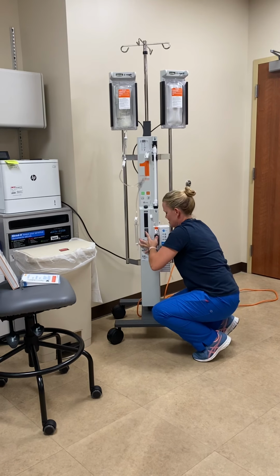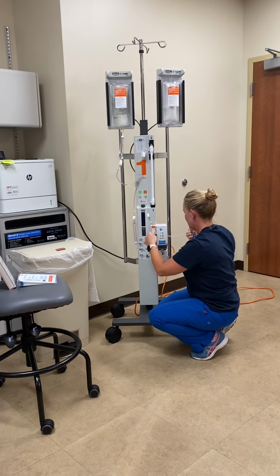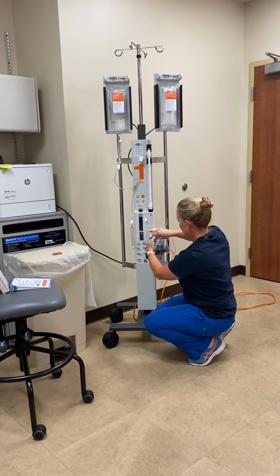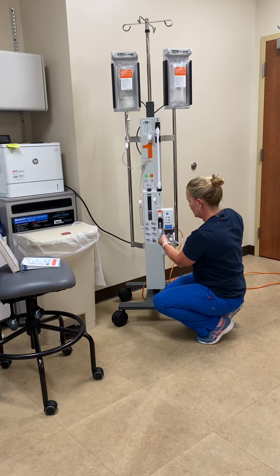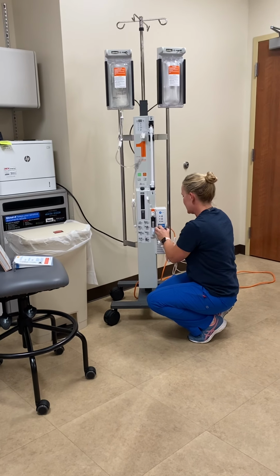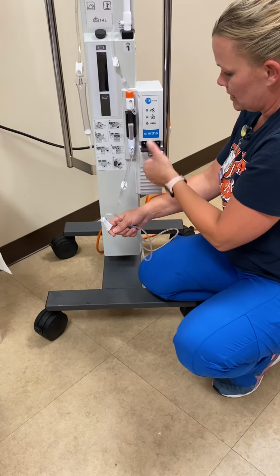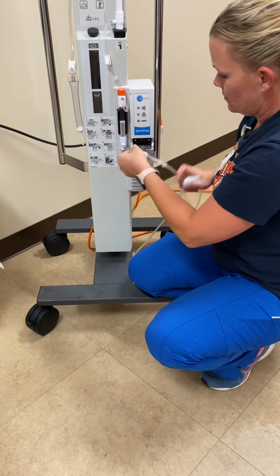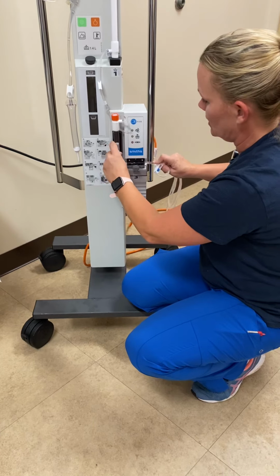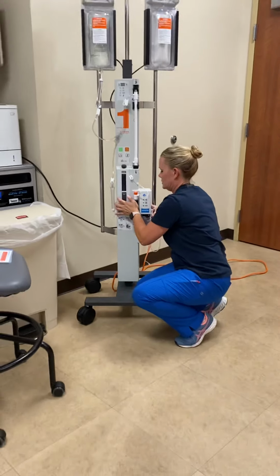Especially when we have tennis elbow. Okay. And then this rubbery part of your tubing down here is going to go to the end over here, and this hard piece goes inside of here. So just FYI, this isn't a quick pop open. You push down on this metal lever, this pops up and over. If you try to do this while everything's in operation, it won't work because you have a tooth that comes out to hold it in there. Come on now. There we go.